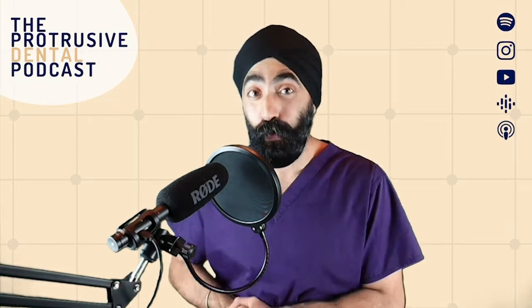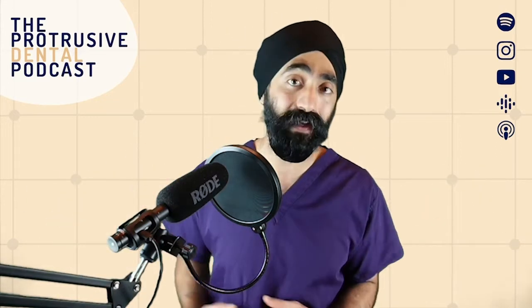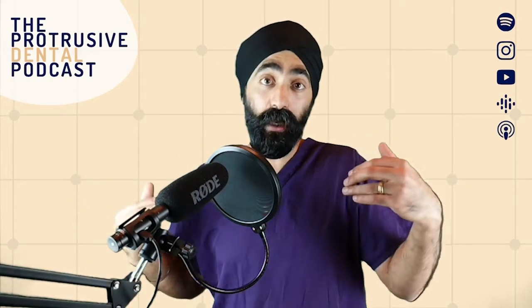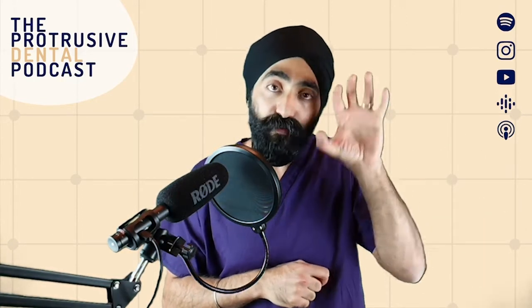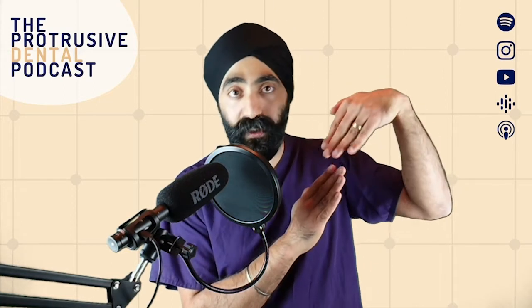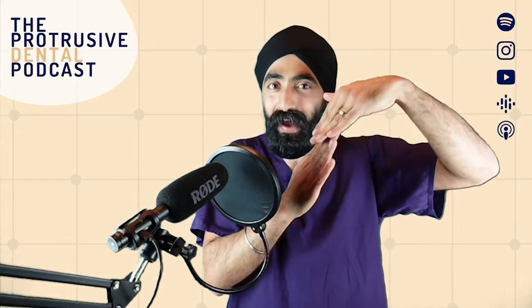Before we jump to the main episode, the Protrusive dental pearl I have for you is probably something I've shared with you before. And I have no shame in sharing it again if that's the case, because I think it's such a huge pearl. If you are going to be using a Facebow, or if not, this is a bite registration tip. If you're planning some restorations, or if you are planning a splint of any type, and you know the final vertical dimension that you'll be working to, for example, you've got a generalized wear case, so you know that you want to lengthen the incisors and open up the bite, and you know the final overbite you're finishing with, you have a pretty good idea of how much you're raising the bite.